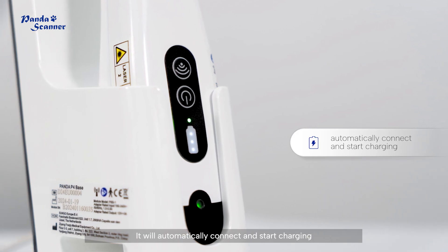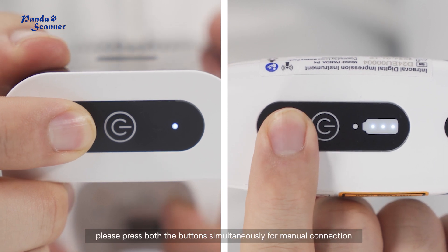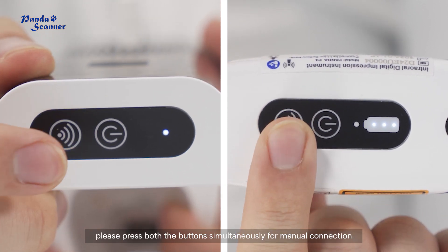It will automatically connect and start charging. If connection fails, please press both buttons simultaneously for manual connection.